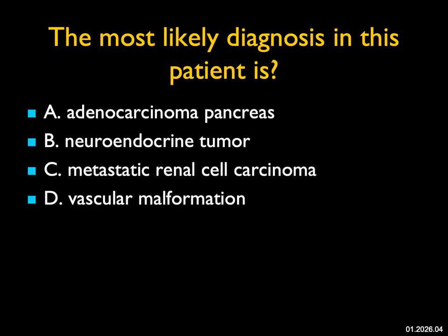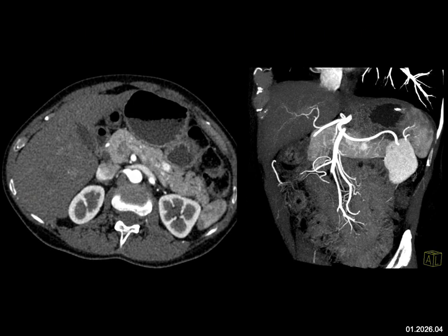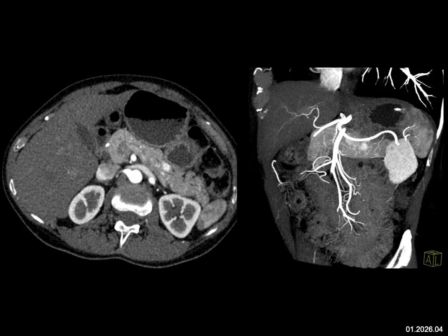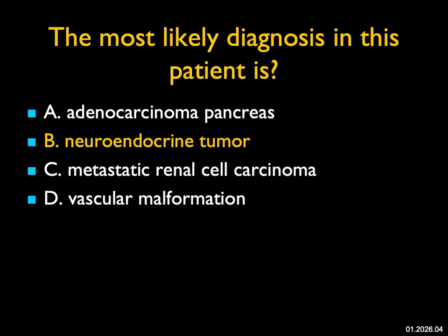The most likely diagnosis in this patient: on the axial views there's about a one centimeter vascular lesion at the junction of the body and tail of the pancreas, seen even better on the coronal MIP imaging. Adenocarcinoma of the pancreas is hypovascular. Metastatic renal cell carcinoma can go to the pancreas and lesions are typically vascular, but the kidneys shown have no evidence of nephrectomy or renal mass. This is a classic neuroendocrine tumor — one centimeter, likely low-grade. Neuroendocrine tumors are easy to miss without arterial phase imaging, and MIP imaging can be very helpful.